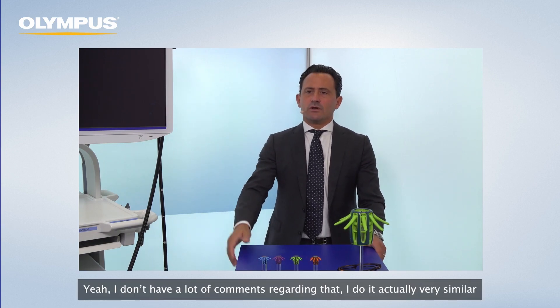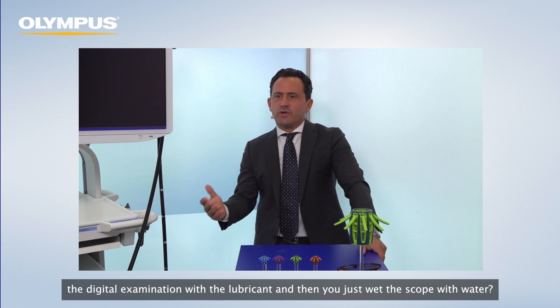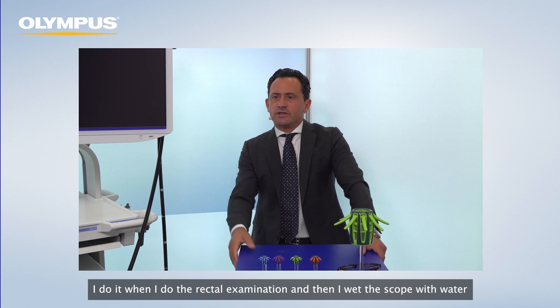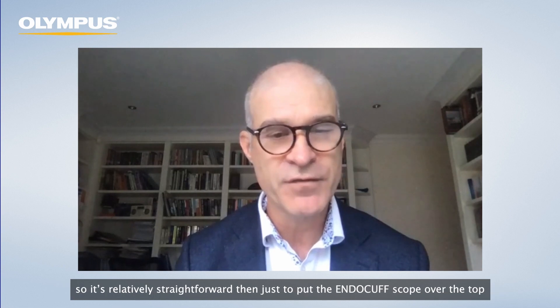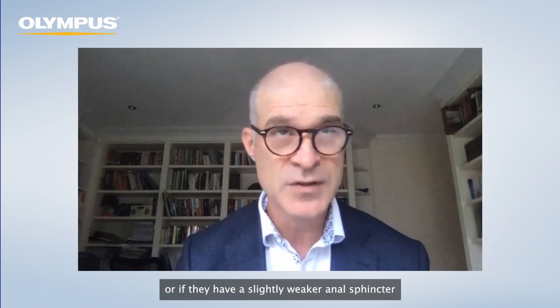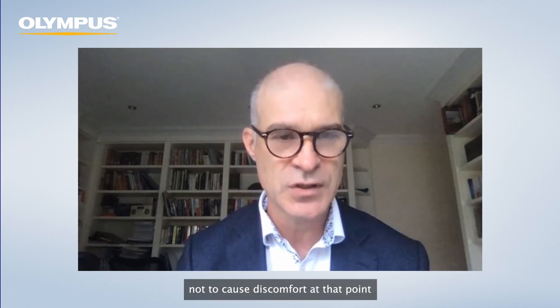Brian, do you put lubricant on the scope, or is it enough to do the digital examination with lubricant and then wet the scope with water? I don't put any lubricant additionally on the scope — I do it when I do the rectal examination and then wet the scope with water. Usually that's more than enough for a gentle insertion into the anal canal. In younger patients with high anal tone, you have to be quite careful not to cause discomfort at that point.